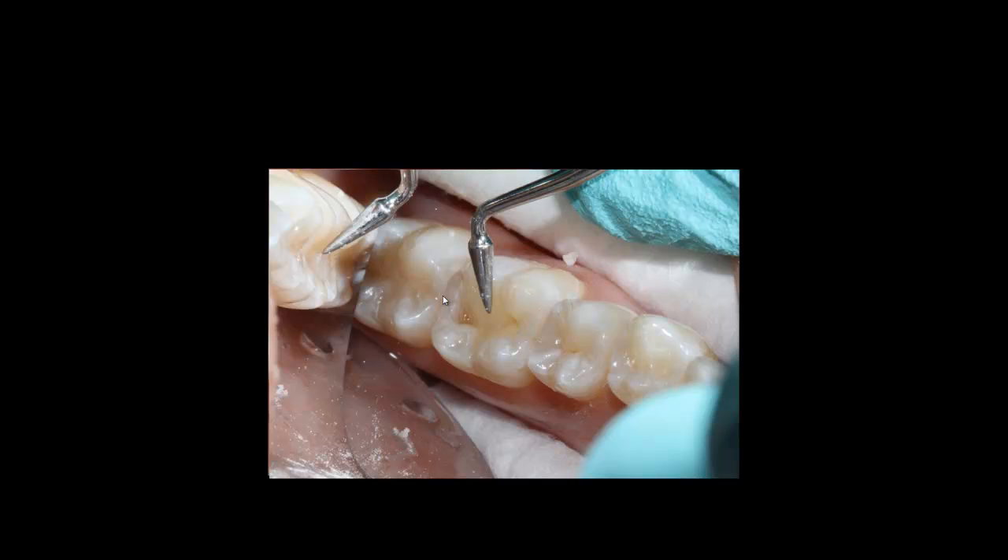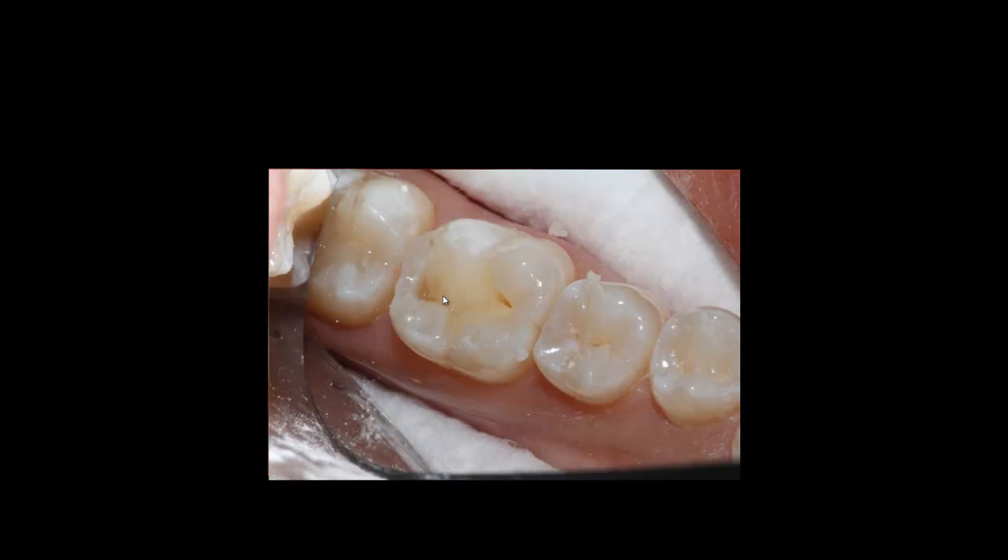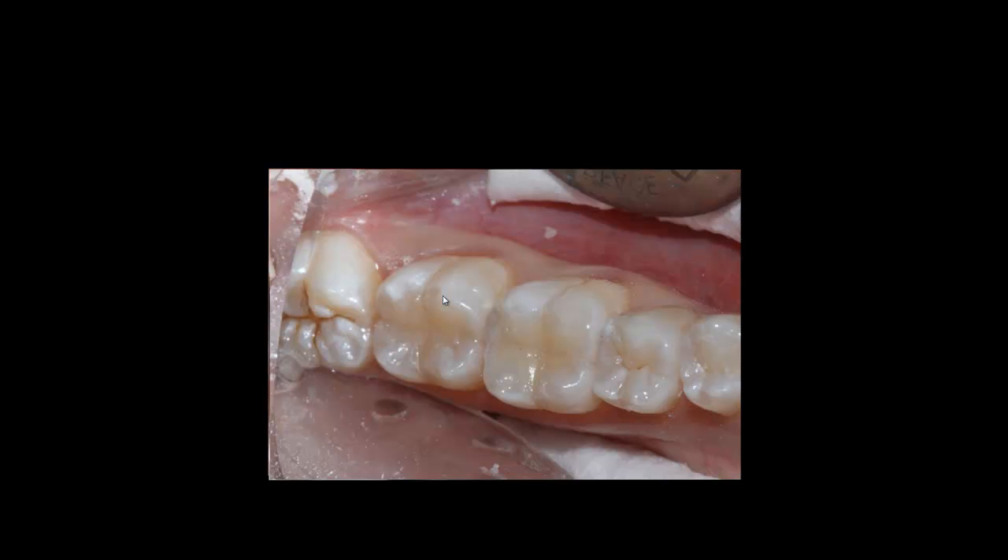I then add another layer to create the natural anatomy of teeth 30 and 31. When the material is applied, you can see the connection between the buccal cusp of number 30 and the mesiolingual cusp of number 30. The final product uses a layering technique — a harder dentin body material at the base and enamel on top. The basic kit includes A2 shade composite, which still blends easily with great flexibility.